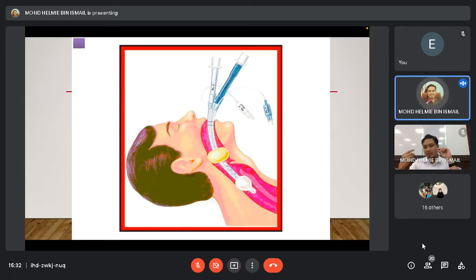Basically, when the tube is inserted into the trachea, it works just like a normal ETT. When you insert it into the esophagus, that is when the function of the combi tube applies. You can use this vented tube and ventilate through it into the trachea. Alright. Okay.